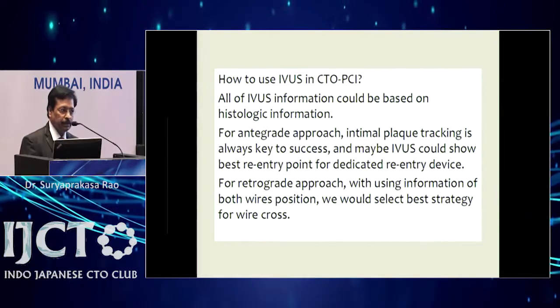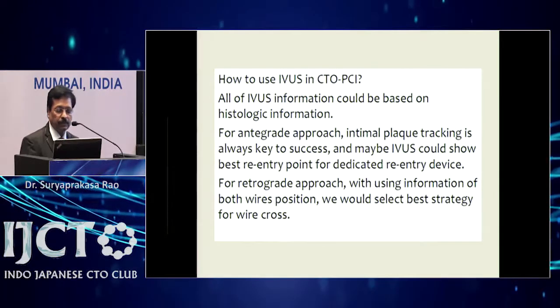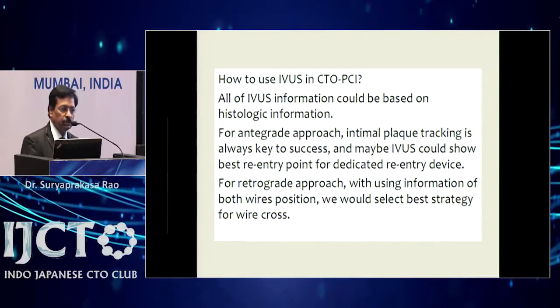The anatomy of the lesion, the morphology of the lesion, and the vessel diameter: these things are very important.